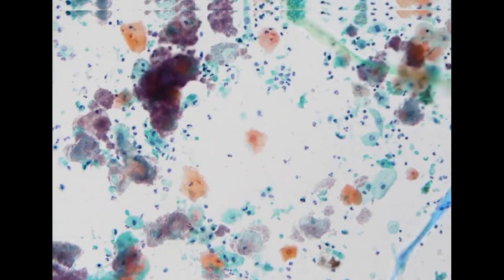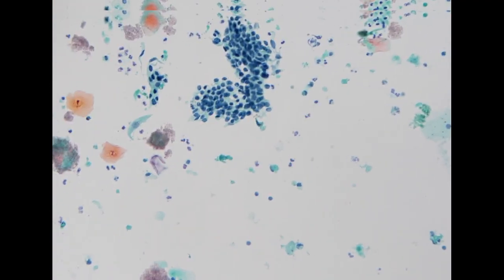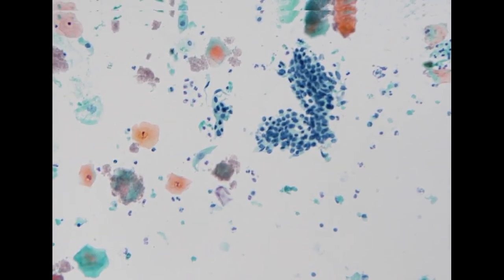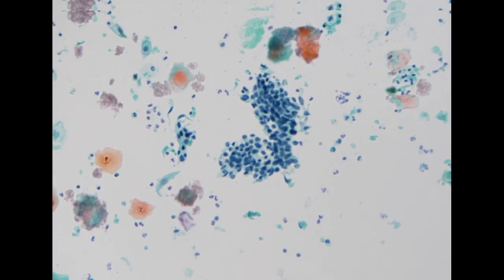So for this specimen, although it seems to be very much like a high-grade urothelial carcinoma, because we don't have any prior history from this patient, and the lesional cells are relatively scant, we call it suspicious for high-grade urothelial carcinoma, but this was initially screened as negative.